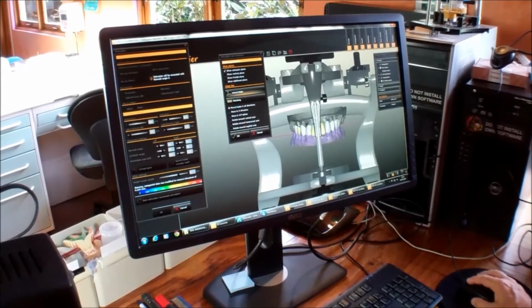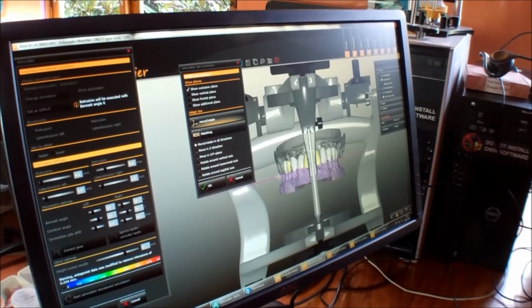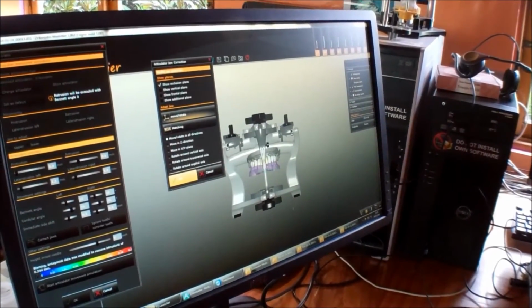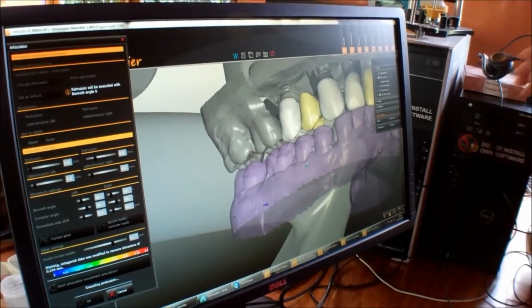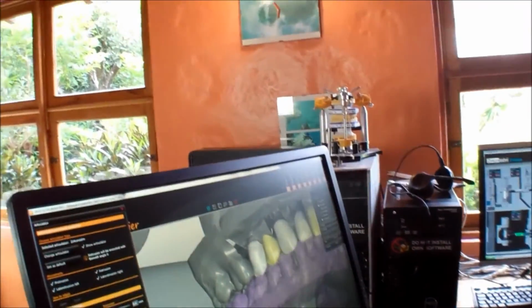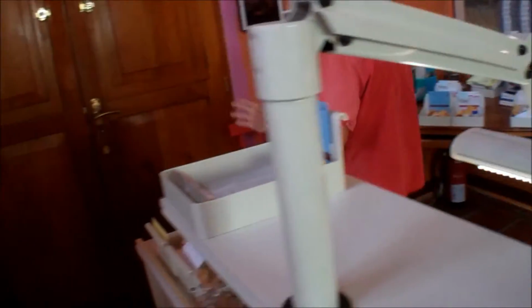This is an individual articulator. You can choose different articulators. So this is the plane that we use, which is going to be parallel with the two eyes. So when I decide this one, what you do is this with your teeth. And then I reproduce this on the bite, and this is the material. This is the special bite, and I'm going to do one for me and one for my wife. I already did it. And we're going to get this tomorrow, because it's the new software. So when you go to sleep, you're going to have a very individual bite with your movement.